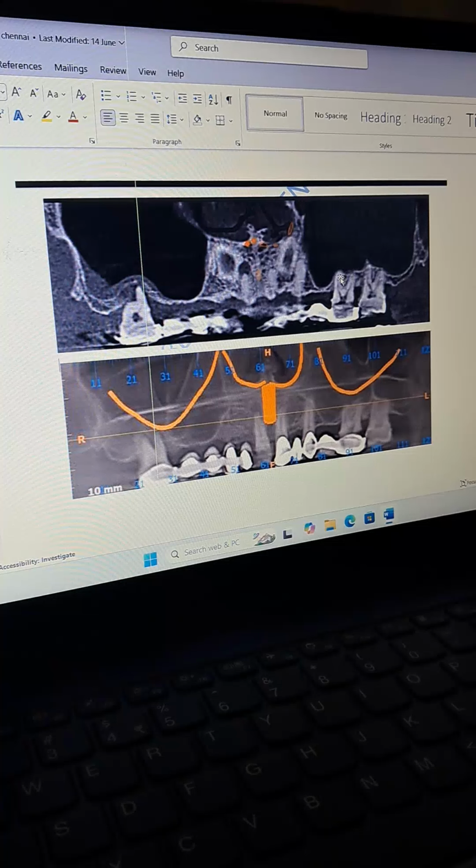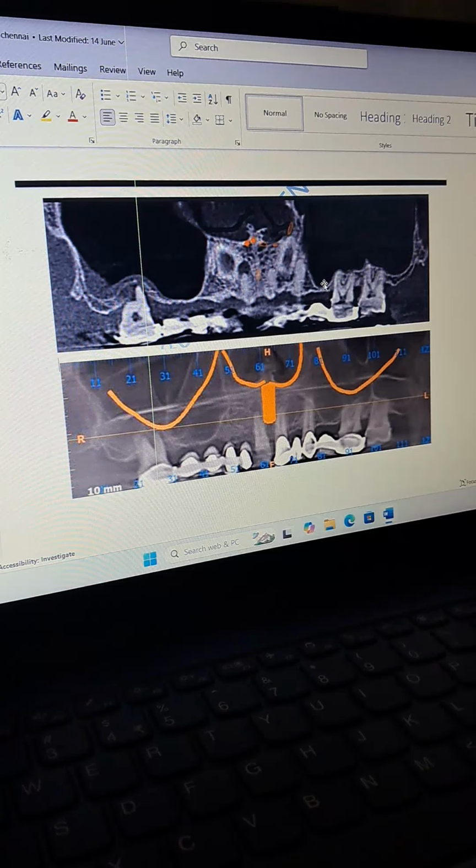So doing a sinus lift on the left side will be more challenging than on the right side, due to the rugged morphology of the bone and the very fragile, friable sinus lining. The implantologists who are into conventional implantology should take note of this.